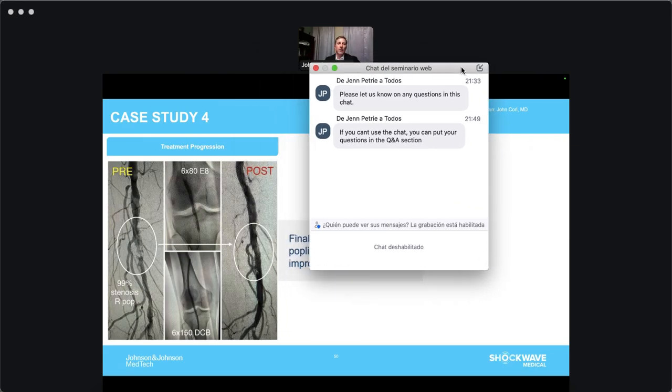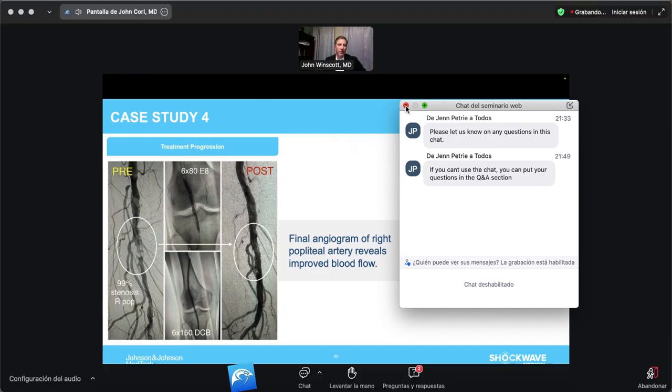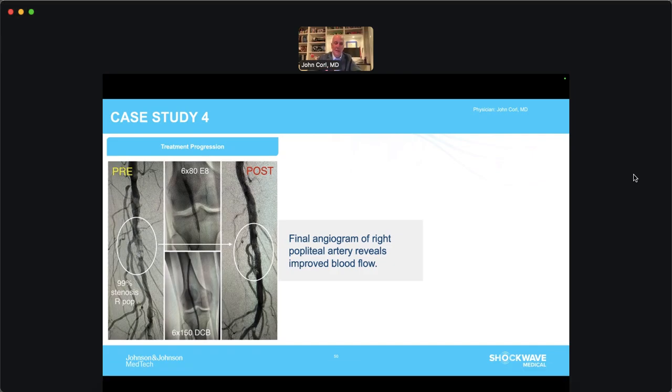The question was, in your experience with Javelin thus far, have you had any window ruptures with either prepping the device or in the body? Yeah, I've had two. One was a prep, which was really my fault. We had a new tech, and we were prepping it, and you need to flush all the way through that loop the first time. So you connect, you open up the stopcock, and you just turn it up to 4, and it takes a while to flush all the way through to get a drop to come out. Once a drop comes out, you turn that knob. Well, this tech, when you watch a balloon, you just keep going up till you see the balloon, and she just kept going up, waiting for that bubble or that drop to come out. So she went up to like 12 or 14 as she's looking and just ruptured the balloon.